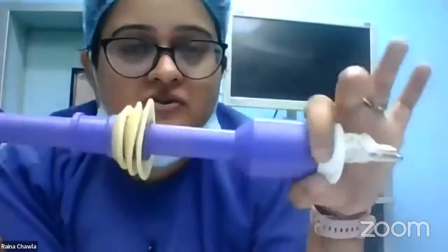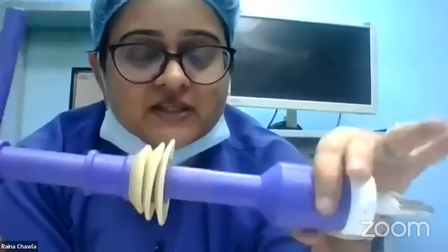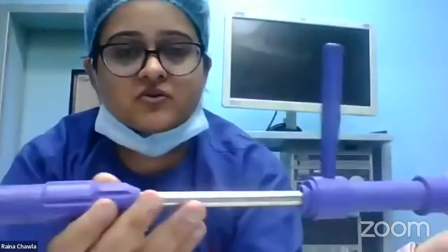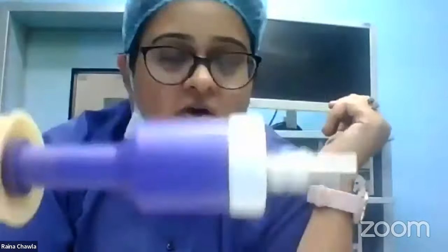Very important instrument in laparoscopic surgeries, especially laparoscopic hysterectomies. This may be asked as an image in your exams, undergraduates also, because it is now being very, very commonly used. Laparoscopic hysterectomy is now becoming the norm for hysterectomy.